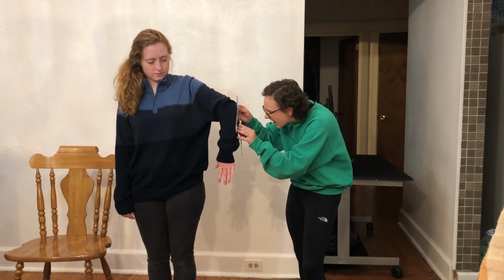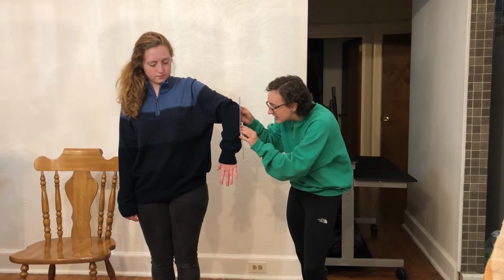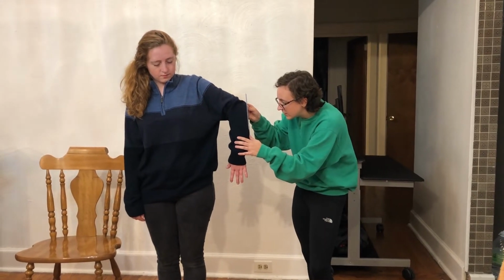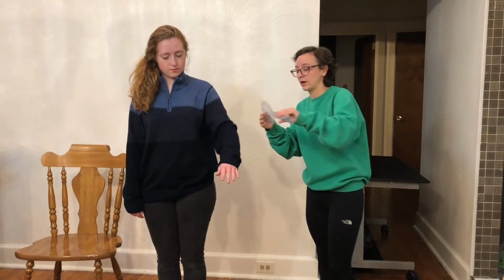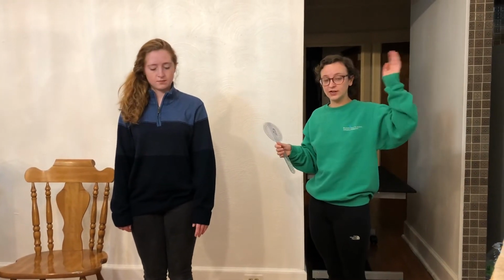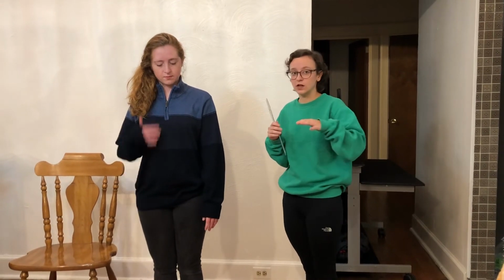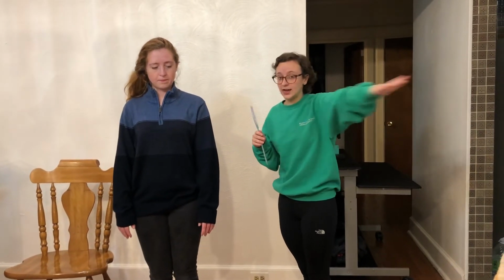And for this one, I'm getting 66, so I'm going to go ahead and see if I can just bring you a little bit further. Great, okay, so that was shoulder external rotation and internal rotation. And lastly, what I'm going to do is horizontal abduction and adduction.